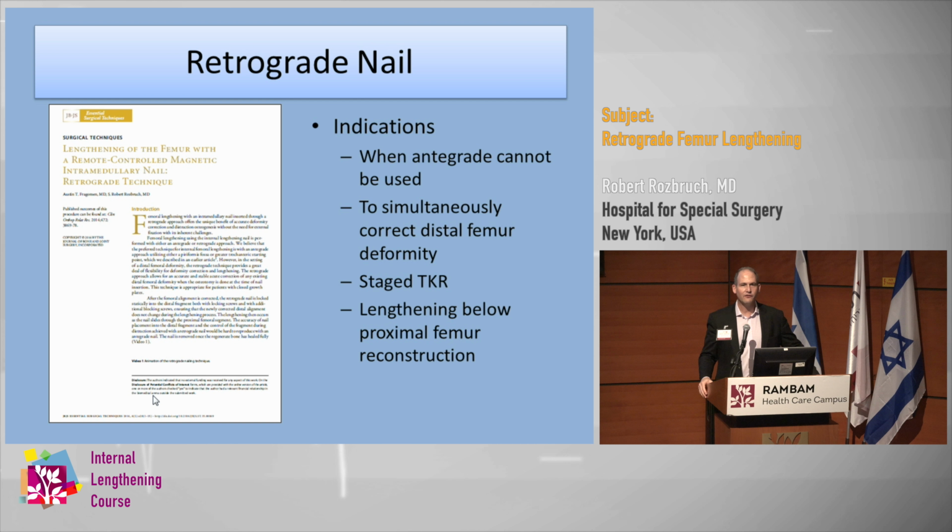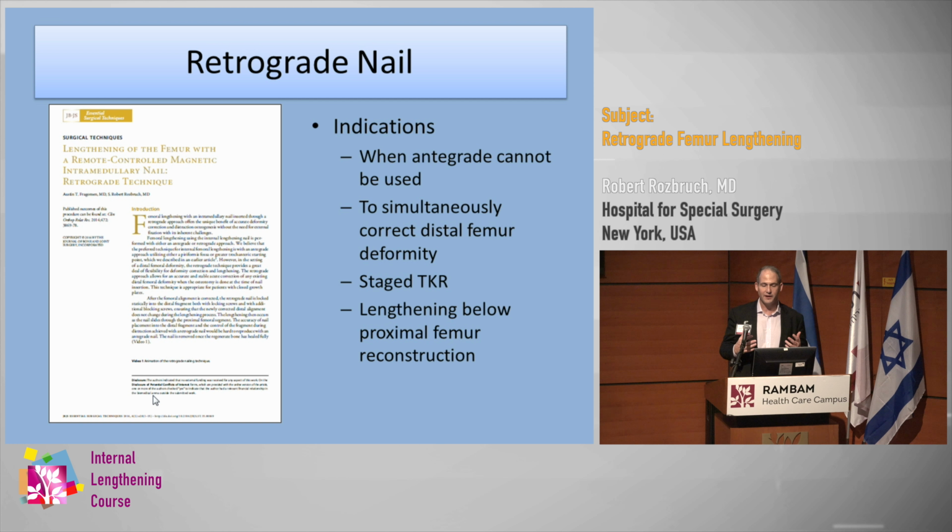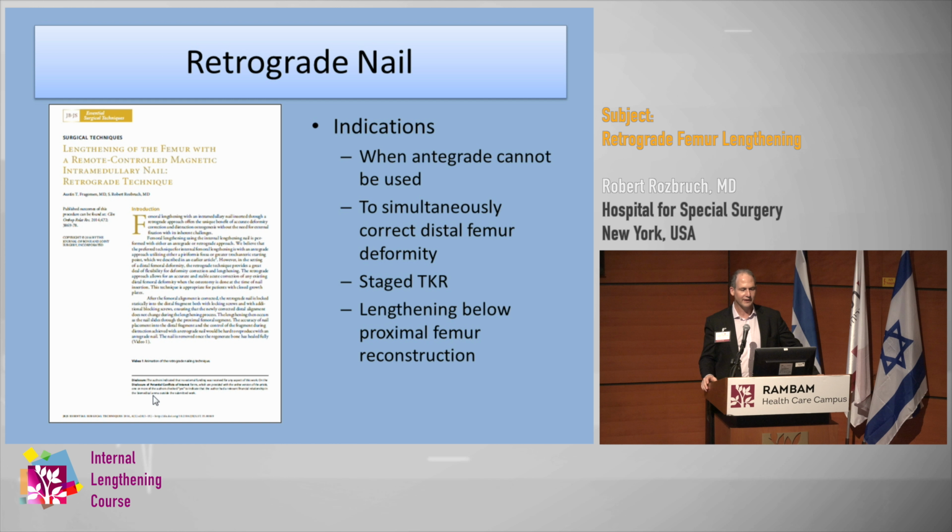So the indications for the retrograde nail, in my opinion, are when the antegrade nail cannot be used, or if you want to simultaneously correct a distal femur deformity, if you want to do a staged total knee replacement, and there's some, you might do it that way. This way you could take out the nail and do the knee replacement at the same time, or if you want to lengthen below a proximal femur reconstruction. But otherwise, in my opinion, the antegrade is sort of the standard technique.